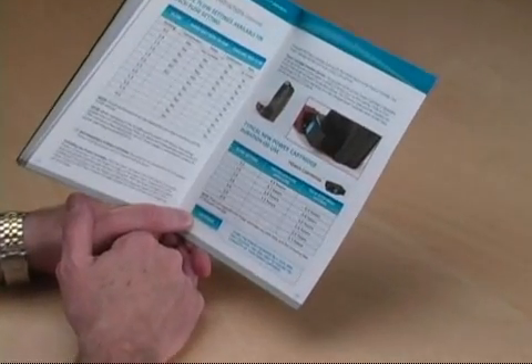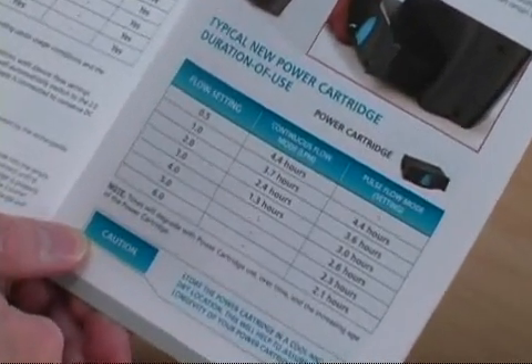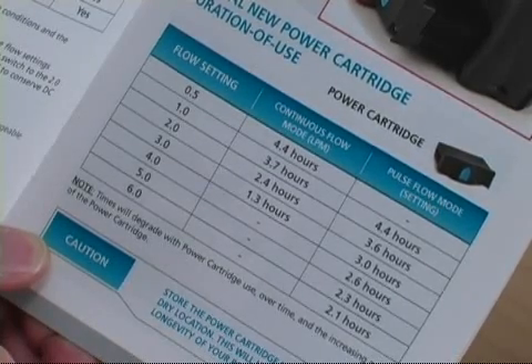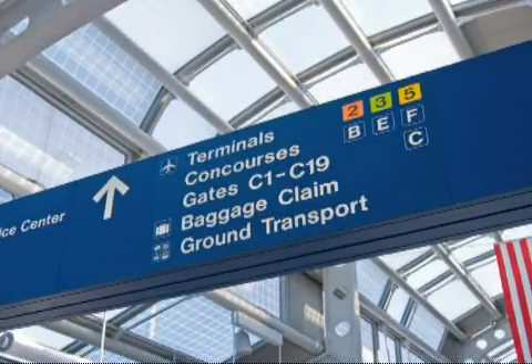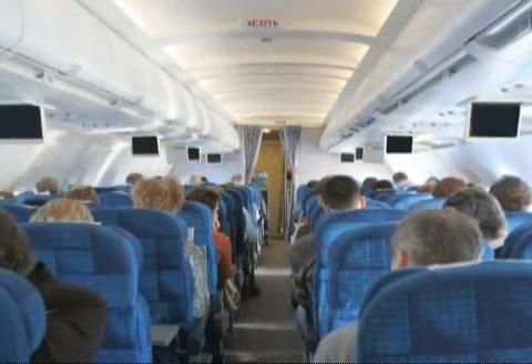The life of your Eclipse II power cartridge will vary with your flow mode and flow setting. So to be certain you have sufficient power for an upcoming trip, please refer to the power cartridge duration of use chart in the Traveling with the Eclipse II brochure that came with your device. Whenever you board an aircraft or train, you'll be able to easily roll the Eclipse II and its attached mobile cart under the seat in front of you.